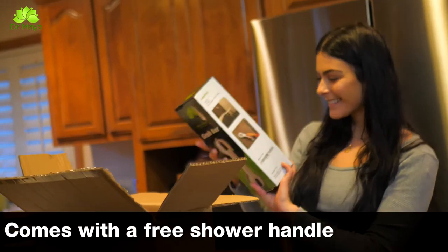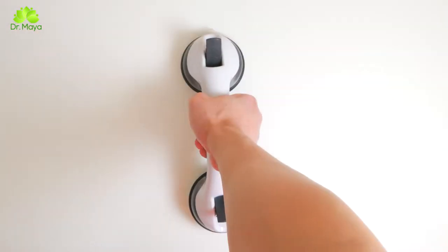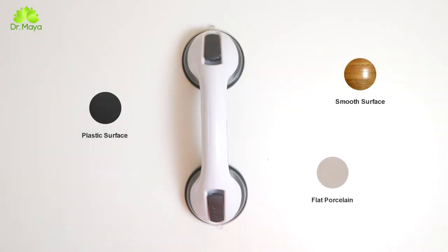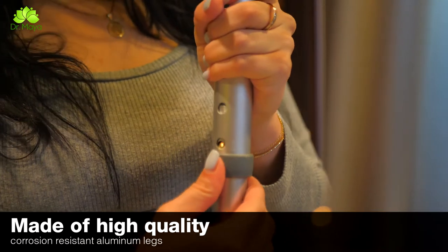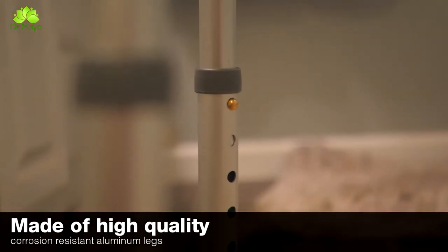Each Dr. Maya shower chair with back and armrest comes with a free shower handle for added safety. Just remember to attach it to any flat, smooth, non-porous surface like tile, acrylic, or glass. It's sturdy and durable, made of high-quality corrosion-resistant aluminum legs, and can hold a weight of up to 300 pounds.